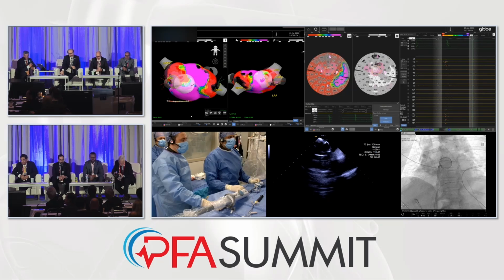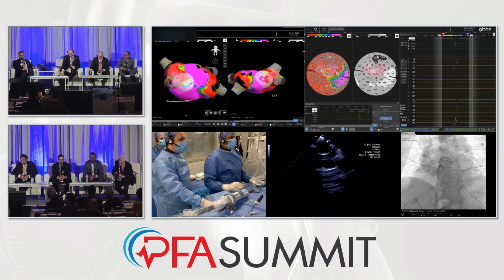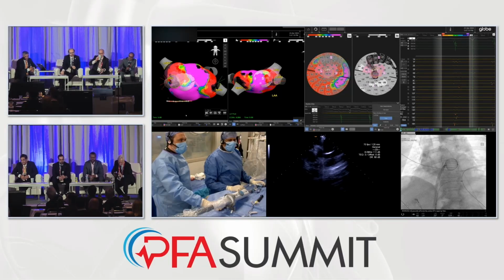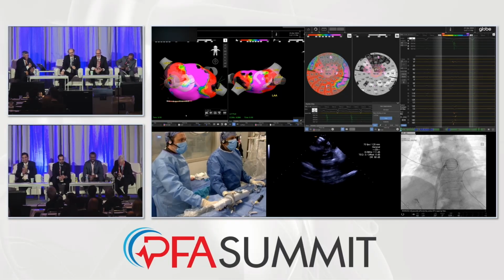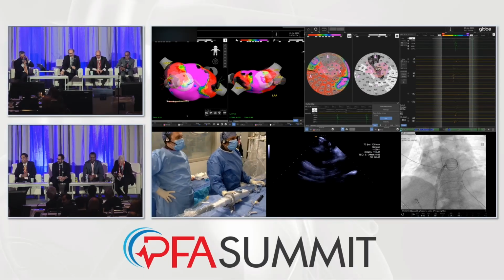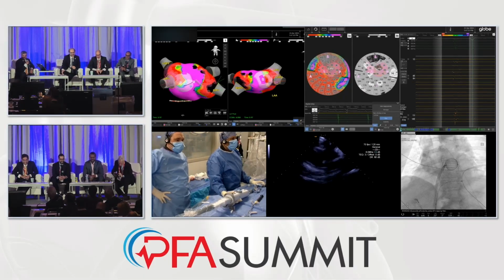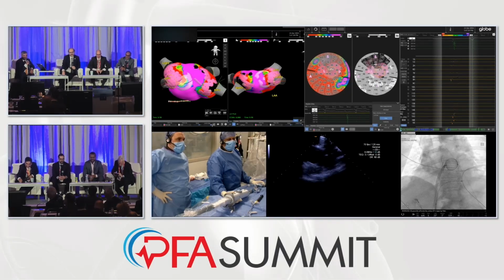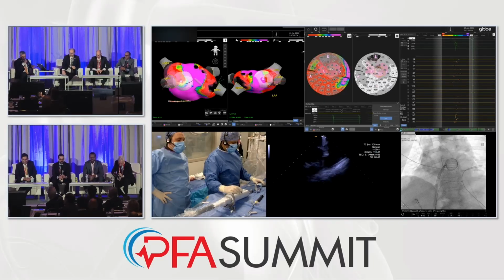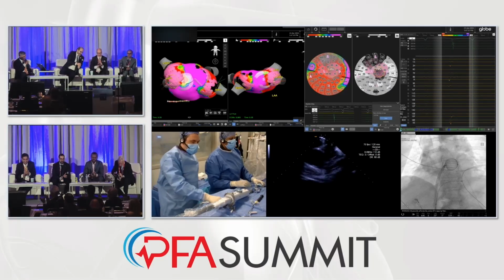Srini, we're down to the last 20 seconds or so. Any final thoughts? No thoughts. I think it speaks for itself. It was one shot for each vein. You got the post-voltage map, and that's what it is. Okay, fantastic. Thank you, Srini. Thanks to the whole team and the staff. Yeah, thanks.